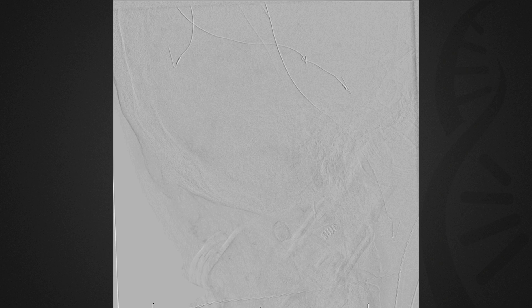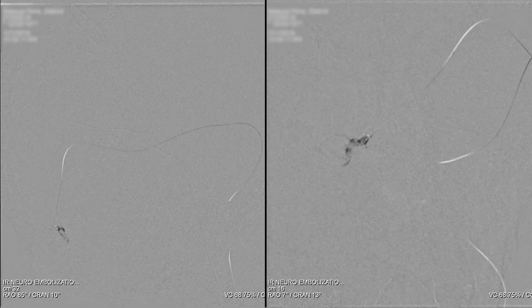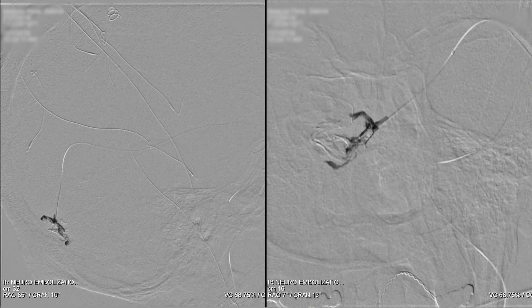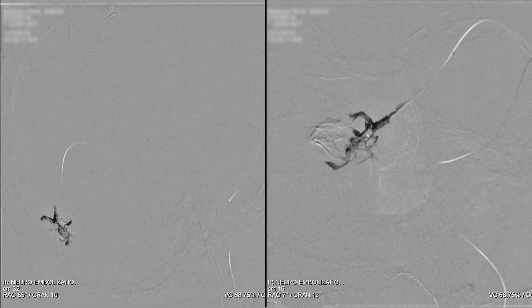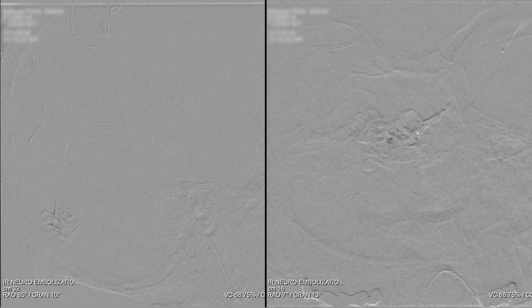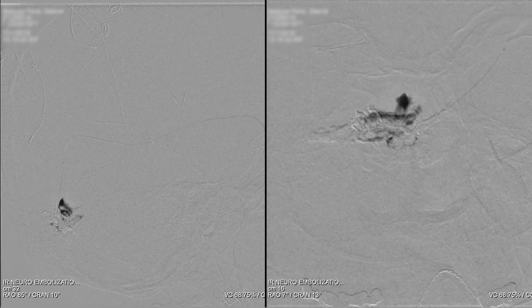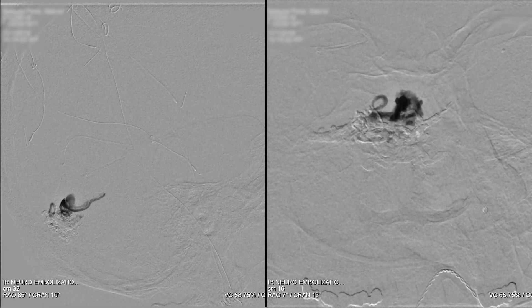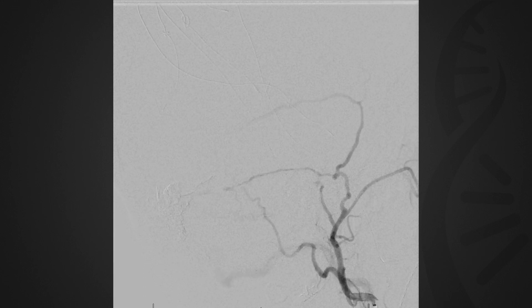The patient was offered endovascular treatment of the fistula. Stage 1 embolization was undertaken using a trans-arterial approach involving the left external carotid artery. The patient was fully heparinized. Using an intermediate catheter for support, a microwire was navigated through an ONYX-compatible catheter into the posterior branch of the middle meningeal artery. ONYX-18 was injected through the microcatheter, with careful attention paid to ensure penetration into the fistula's pouch. Post-embolization angiography confirmed partial embolization of the fistula.